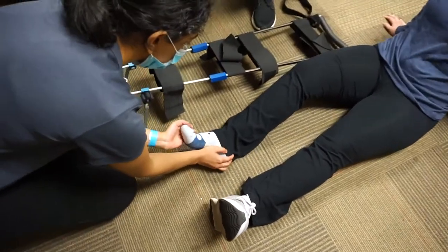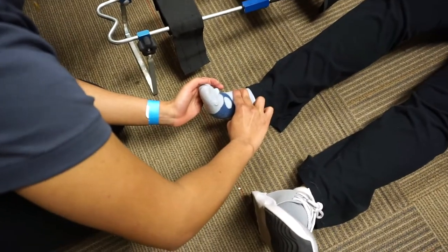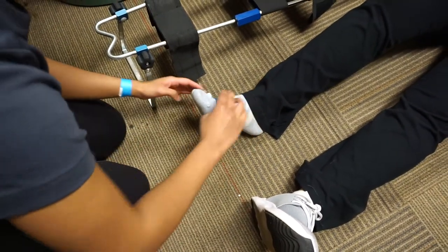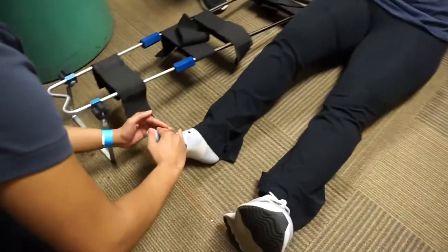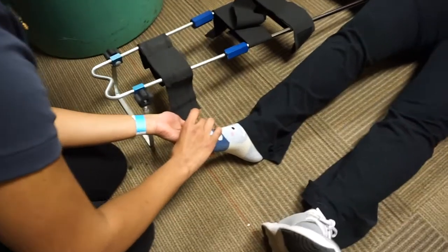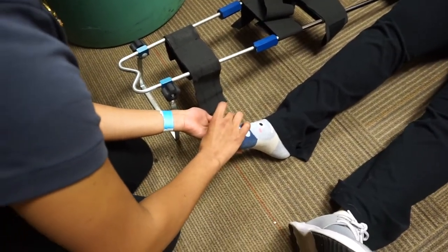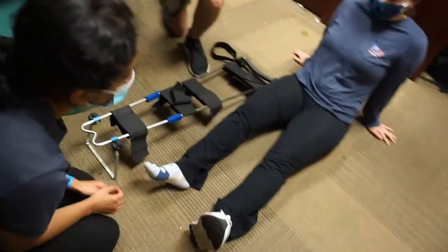Diane is going to come in and assess for pulse, motor, and sensation. Pedal pulse — is it present? It is. How do you test for motor? I'm going to ask her: can you press down on my leg? She can't do it. Can you press up? She can't do that either. For sensation: can you close your eyes? Can you feel what I'm doing? Are you pinching my toes? Okay, sensation is intact.